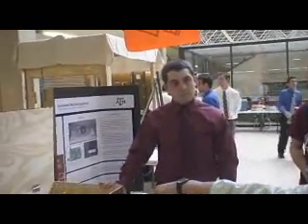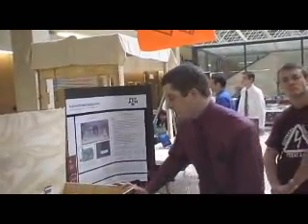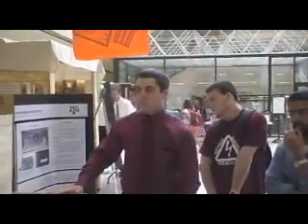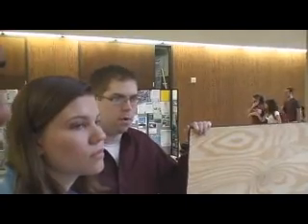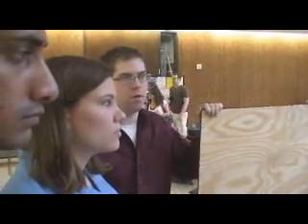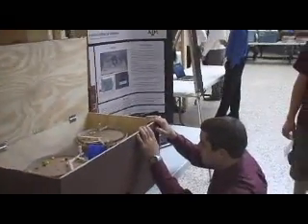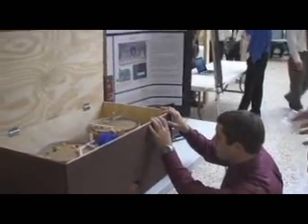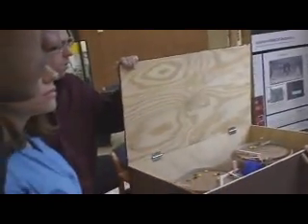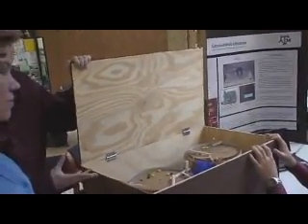Can you make it dispense and then within a minute dispense again? Well, not within a minute, because we programmed it so that people wouldn't want to take their pills at 12:23 p.m. They would probably be taking it at 12 or 12:15. We did it in 15-minute intervals that they can program because these are times they'd have preset for every day. At least that's the idea we were going with, because they're not going to want to program this every day. They just take it at the same time. But for demo purposes, what is the fastest increment you can do? We can change the clock to make it dispense twice an hour.